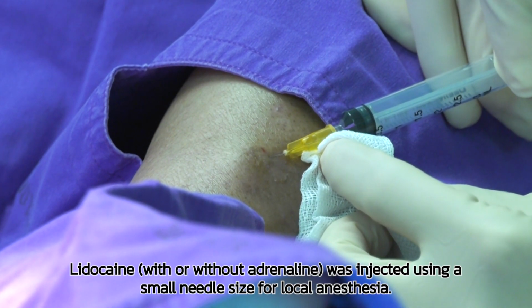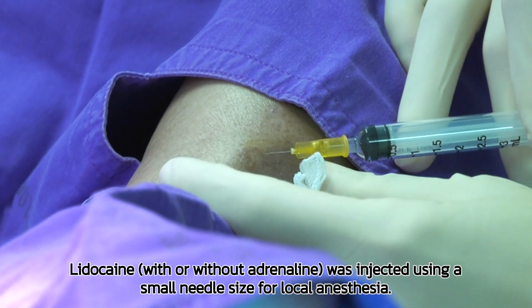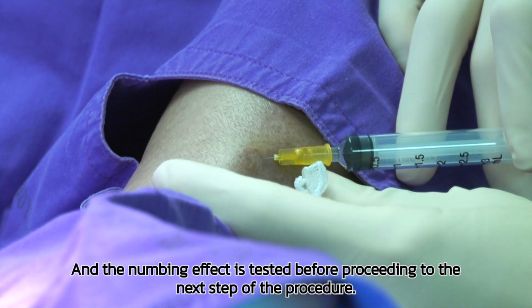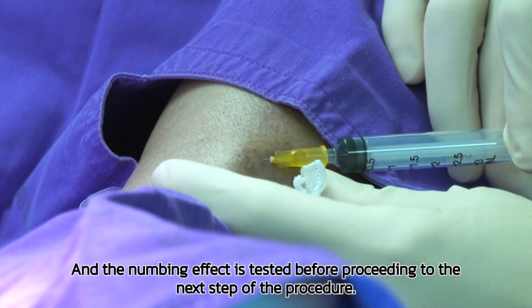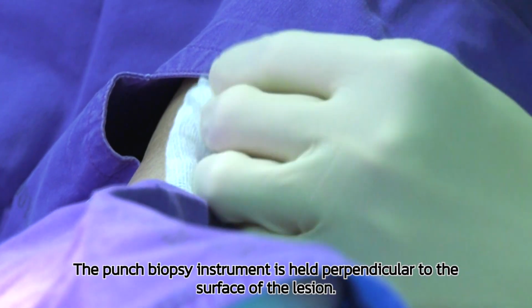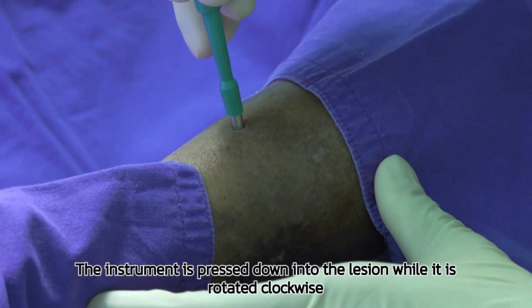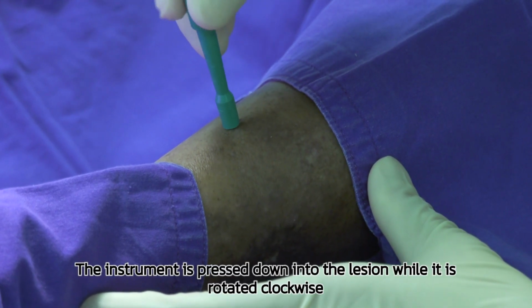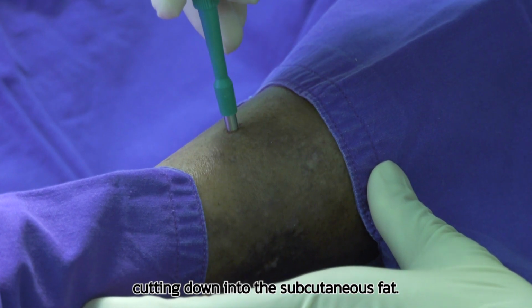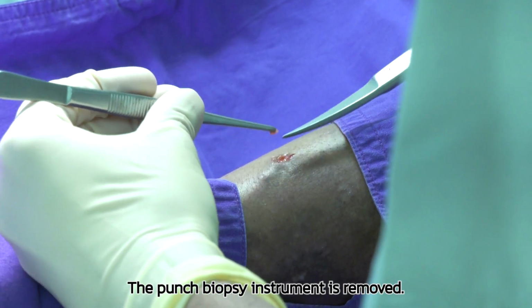Lidocaine, with or without adrenaline, is injected using a small needle size for local anesthesia, and the numbing effect is tested before proceeding to the next step of the procedure. The punch biopsy instrument is held perpendicular to the surface of the lesion. The instrument is pressed down into the lesion while it is rotated clockwise and counterclockwise, cutting down into the subcutaneous fat. The punch biopsy instrument is removed.